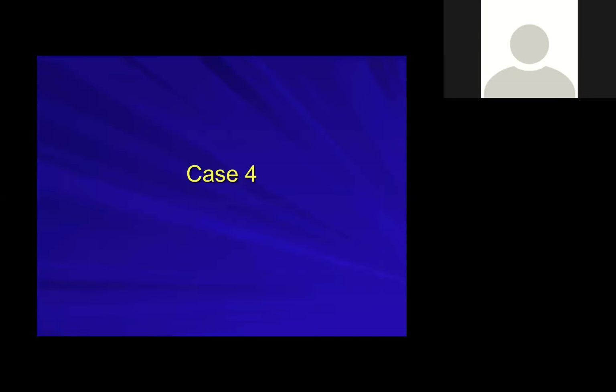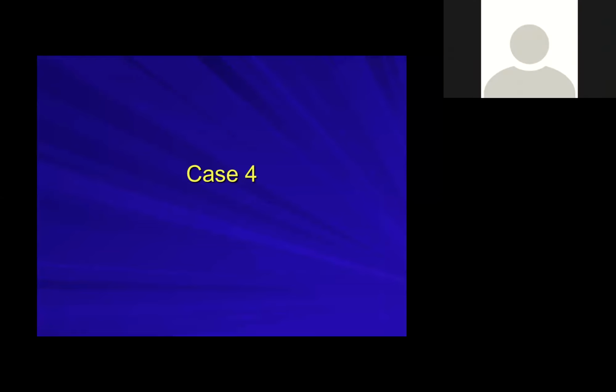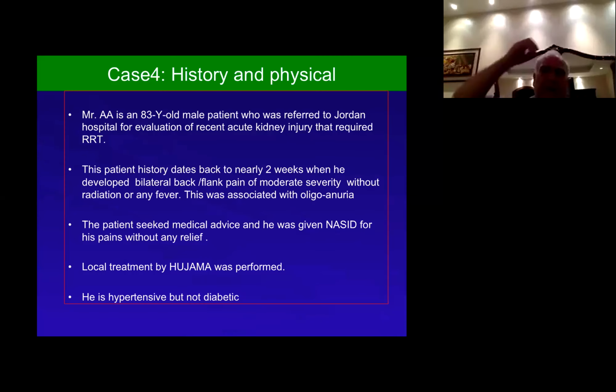No. Yes, sir. Okay, sir. Any question about this case? No, sir. Go ahead. Go ahead, please. Okay. Now the other one, again, 30.